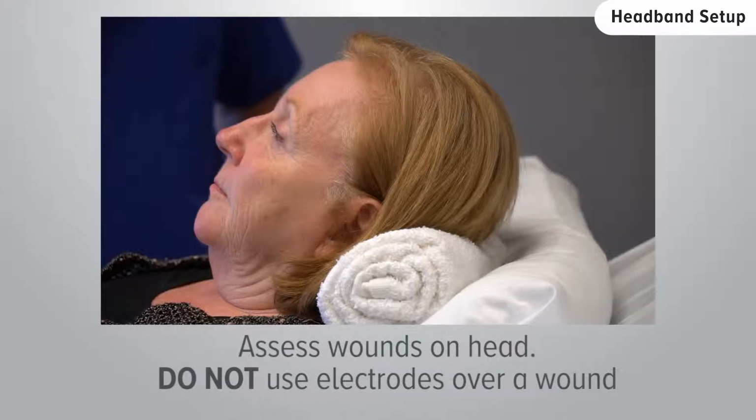Assess the patient's head for wounds and do not turn on electrodes that cover a wound. Confirm with a physician when in doubt. If needed, you can position the headband to avoid any wounds. Notify the ordering physician and also use the Add Note function of the EEG recorder to note this in the recording.